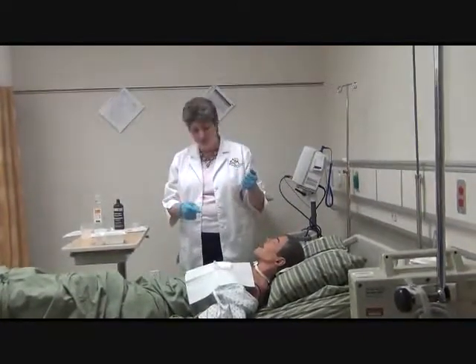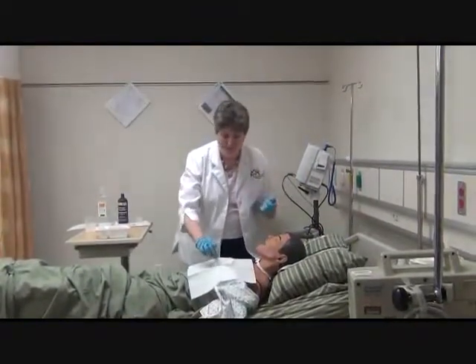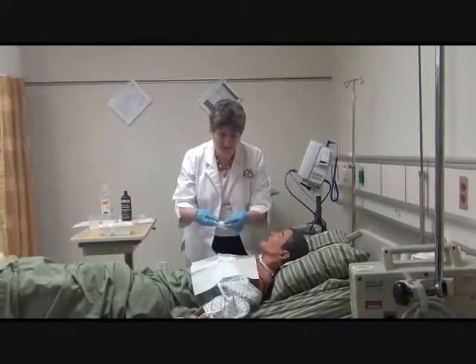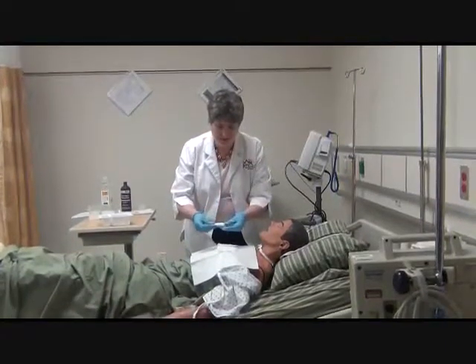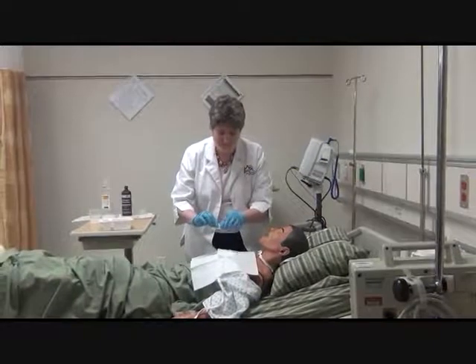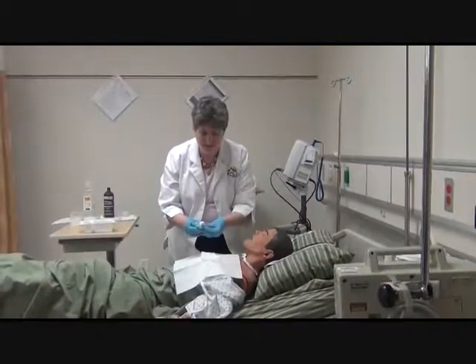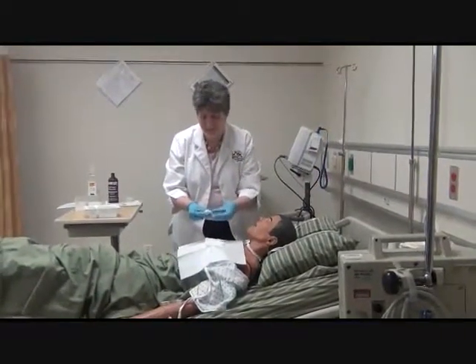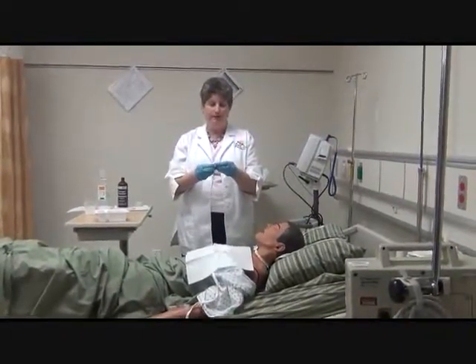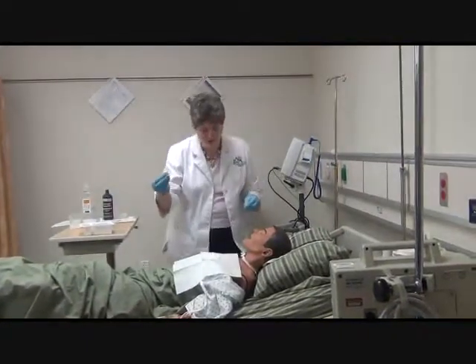I'll show you a way to fold your gauzes also so that you make a tip that you can do that. We're going to take the gauze, and one of the ways that I like to fold it is kind of get it into threes, and then kind of fix it so it makes a point. You can dip that in your saline. If you have the tweezers, you kind of get it so that it extends. You don't want a lot of water, so make sure that you get that off.